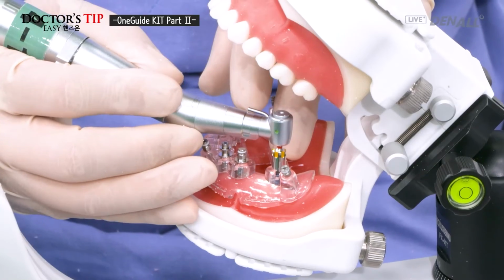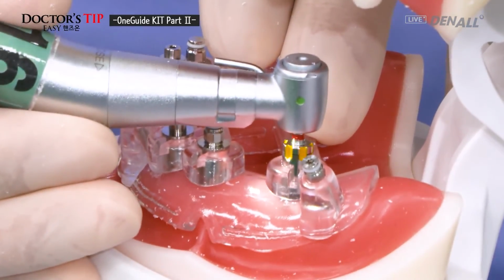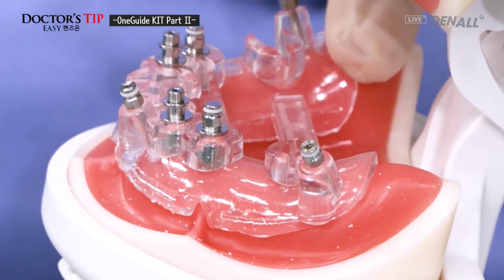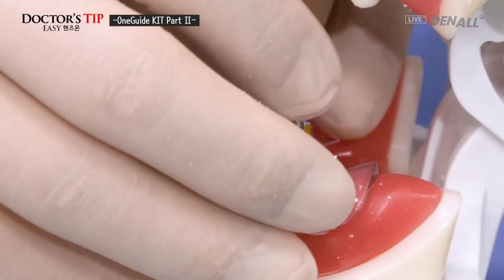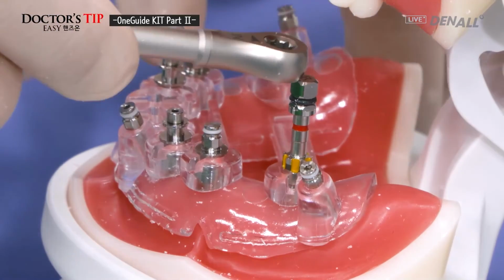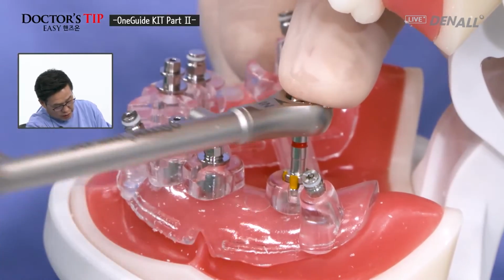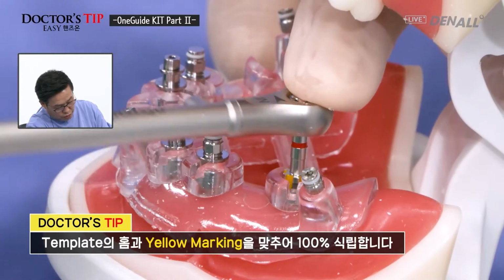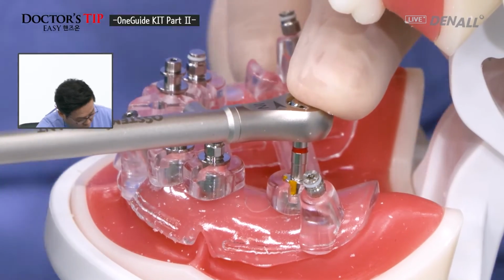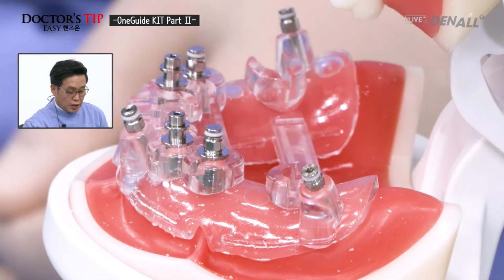And on number 36, implant is being placed. With engine, connect approximately 80% and then connect the wide type fixture driver, and then as shown, do depth control as well as hex control. On both sides, you check whether it fits well, and then it's done.